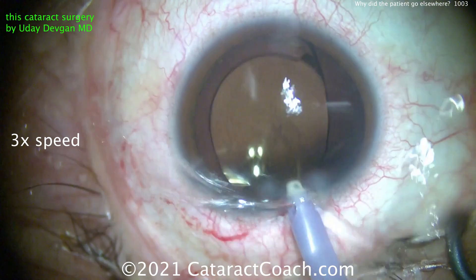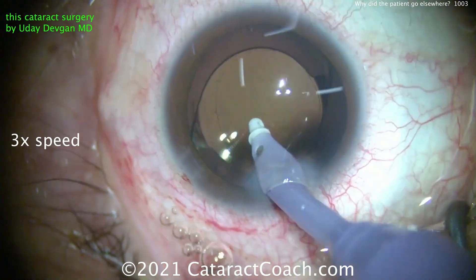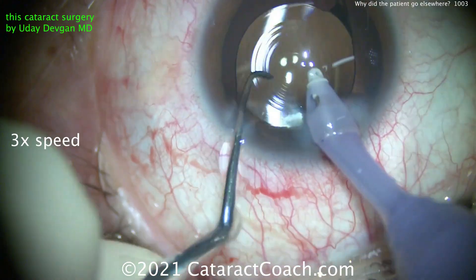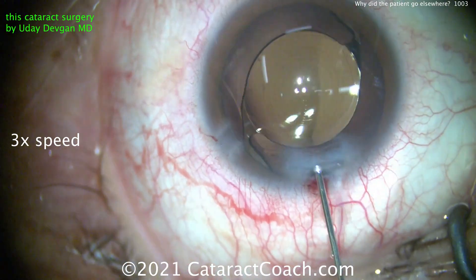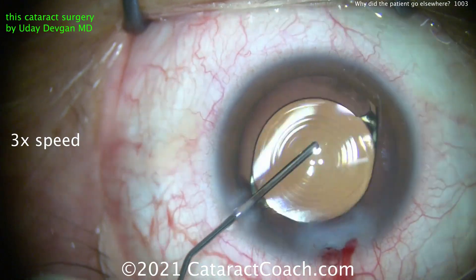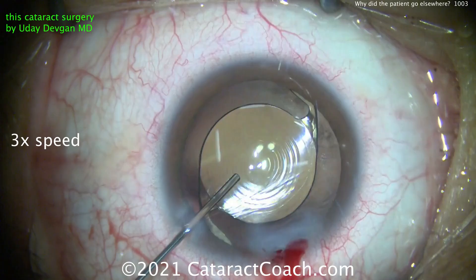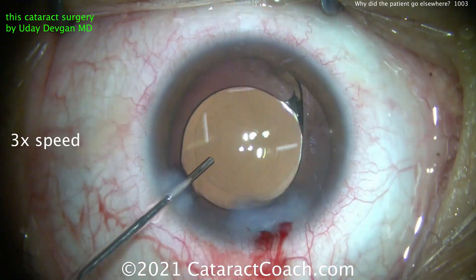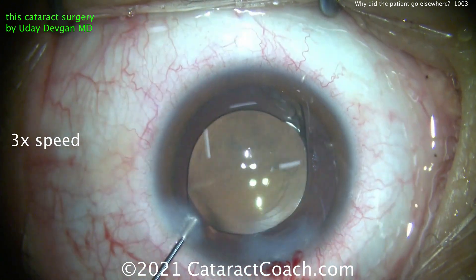The lens is in good position. Now let's take out the viscoelastic, and at the very end here we're going to do a little limbal relaxing incision opposite the main incision, also at the 90-degree meridian, in order to help really neutralize that 0.6 diopters. Sealing the main incision right there — that looks pretty good. Really getting that lens to perfect centration. We want those Purkinje images lined up beautifully with no parallax at all, right in the center of that lens ring — that looks perfect.